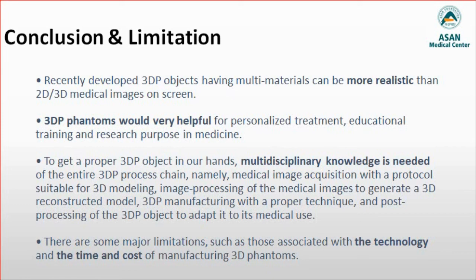In this study, we presented the practical medical applications of 3DP that are based on currently available 3DP technologies. It is hoped that this article will help its readers to understand the various 3DP medical applications and find a way to incorporate them into their clinical practice.